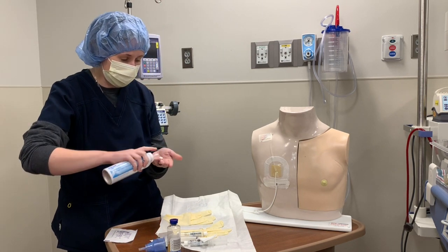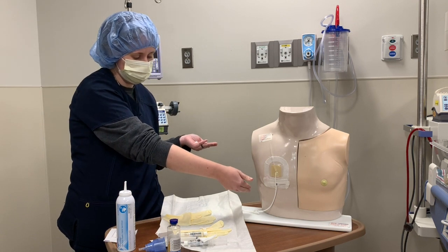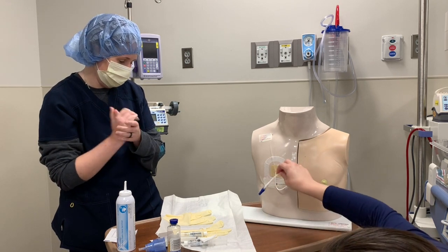If I have someone helping me — like Christina — sometimes what I'll have them do is place the line on top of the sterile field just so it's not touching the bed.